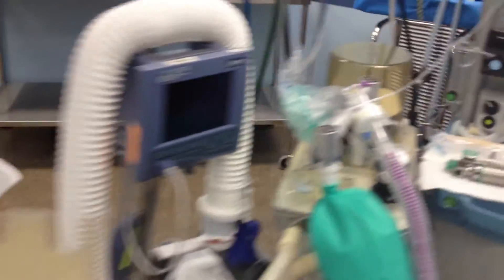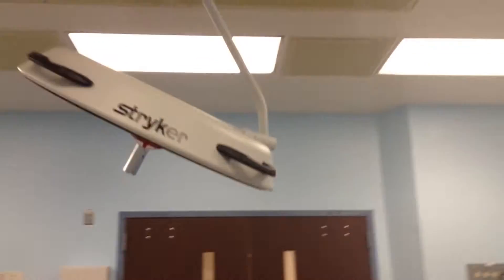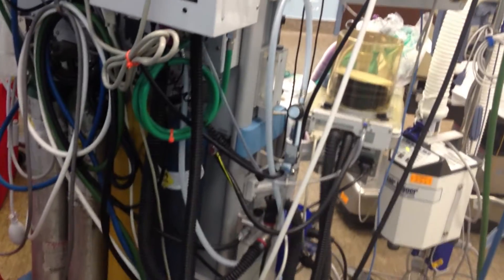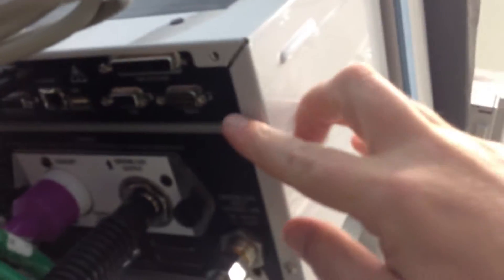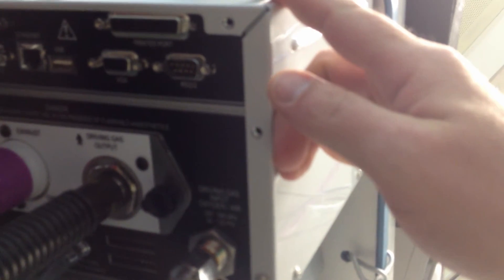We're going to walk around and check out what's back here again in the OR. Let's try to get a wide shot of it. There's the device back in the back — you've got to go under this part of it. And there's your RS-232 right there that we're going to go ahead and hook into.